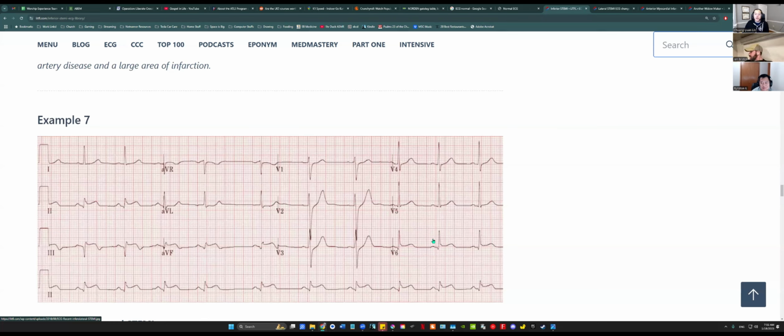Well, how about this? When you look at the rhythm on the monitors, if your eyes can start identifying these ST changes on a cardiac monitor, what would you do if you saw it? Not my problem. I'm just kidding. Tell the nurse they might want to get an EKG. Yeah, exactly. Take a clinical picture. Like, hey, your patient's diaphoretic. I'm seeing something funky going on.